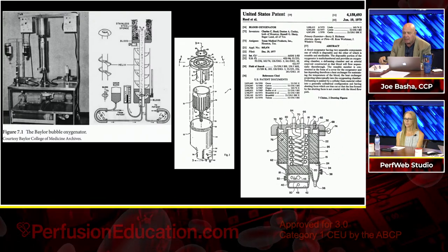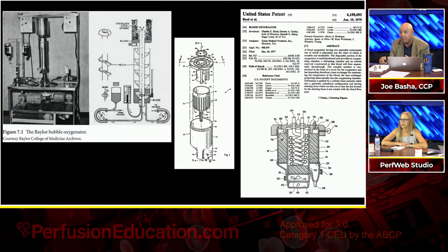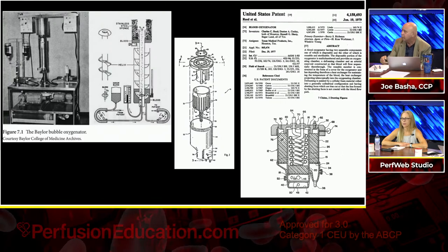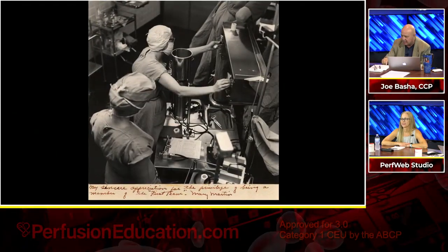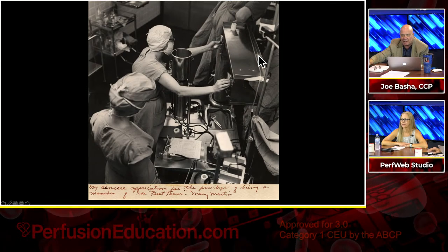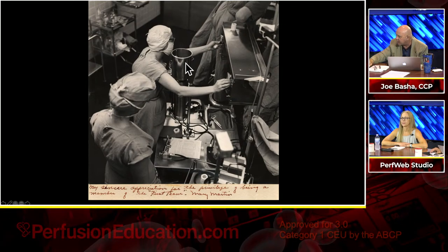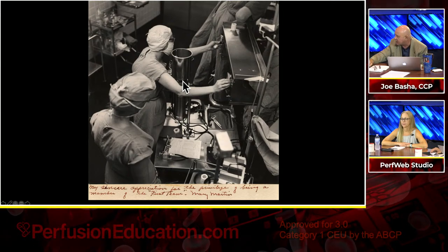On the left, of course, you see a picture of the actual device. In the center, the smaller picture is the European patent diagram. And then on the right is the United States patent for this. It was produced, marketed, and sold as the Cooley coffee pot or Baylor bubble oxygenator. And here is Mary Martin actually using the device. Here's Mary Martin, obviously. Here's the pump, the patient's over there, and here is the coffee pot oxygenator right here. That's basically what it is. It's just a big restaurant coffee pot that was modified internally. And it has, of course, stainless steel sponges coated with Dow Corning Anti-Foam A.